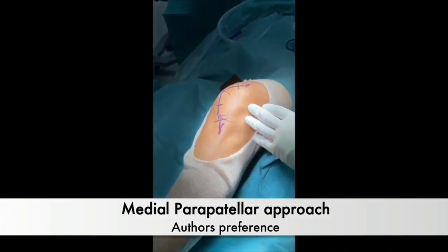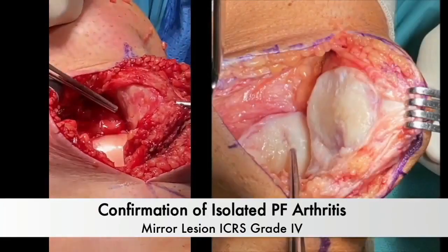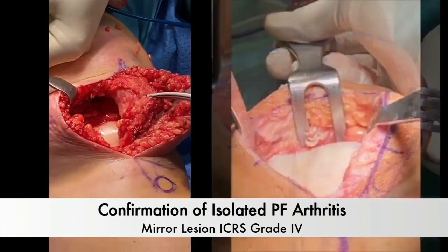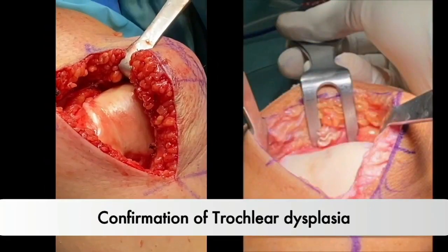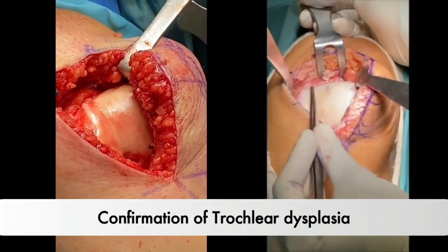Our approach follows the medial parapatellar technique as per the author's preferences. Upon entering the joint, we meticulously assess isolated femoropatellar arthritis, the unaffected femorotibial joint, and any potential trochlear dysplasia.